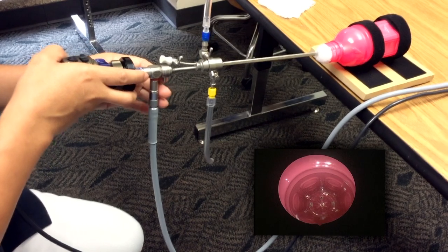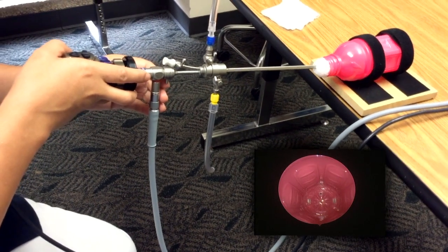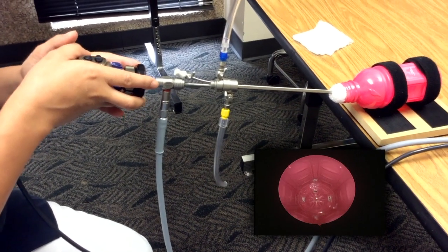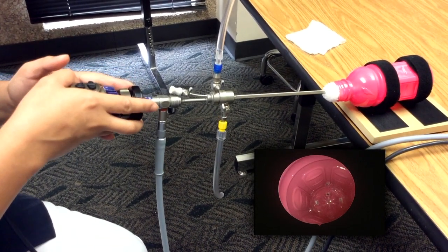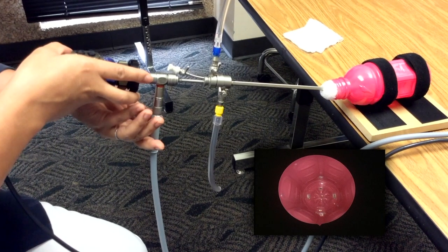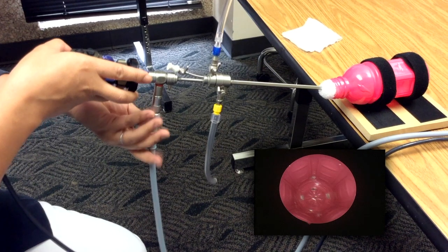Once through the cervix, obtain a global view of the uterine cavity. Here, you should see 5 to 6 of the letters and symbols located on the anterior, posterior, right, and left walls of the uterus. Your goal for this portion of the task is to correctly orient the light cord and navigate the camera in order to place each letter or symbol into the middle of your view with correct orientation and focus to occupy at least 50% of your view.